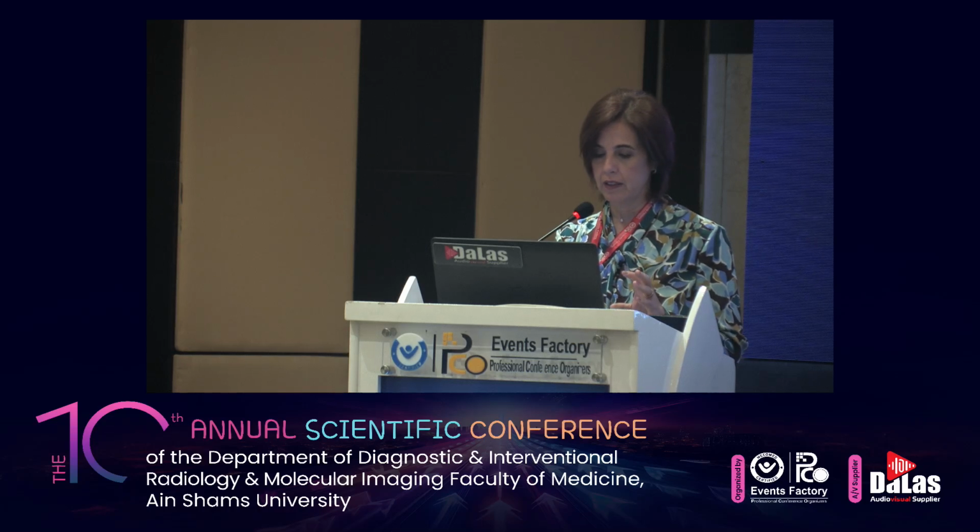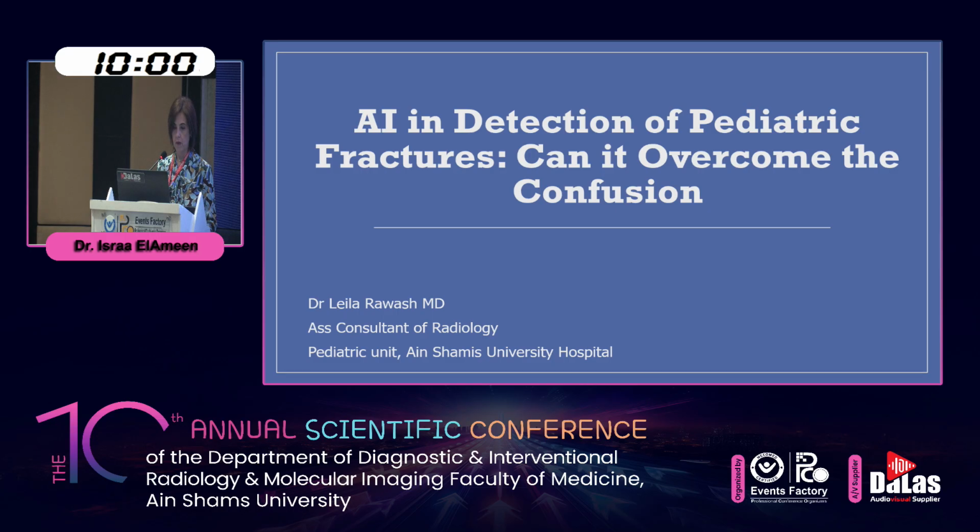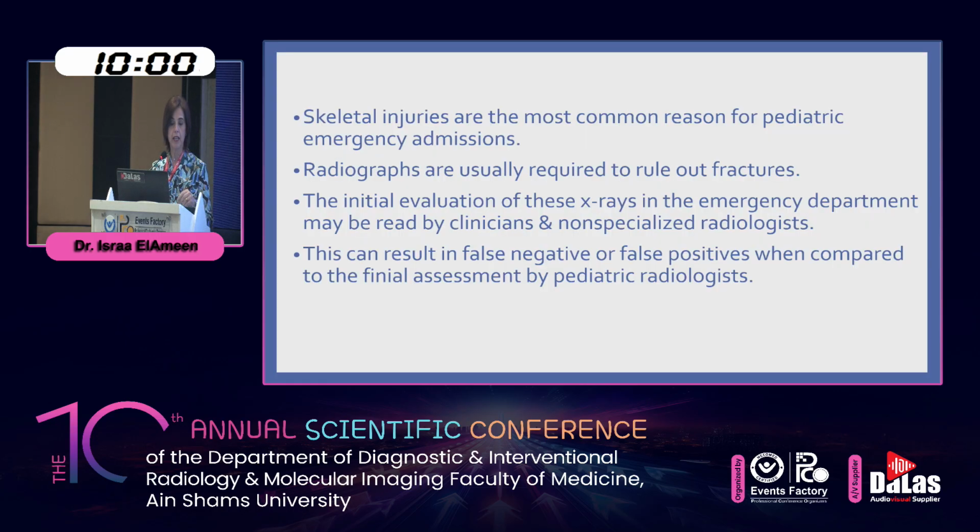Because this is one of the problems we have with the day-to-day work. Skeletal injuries are one of the most common causes for children to be taken to the emergency room. Usually, if the child falls, or if there's any kind of trauma, you go and do an x-ray. But who looks at these x-rays? Most likely, it won't be a specialized pediatric radiologist. It could be anybody. So the fractures in children are much different than the fractures in adults.